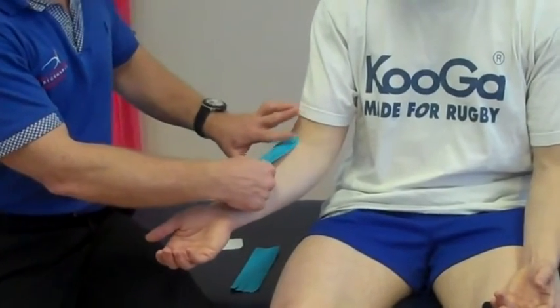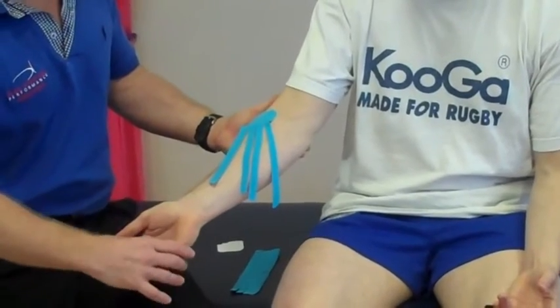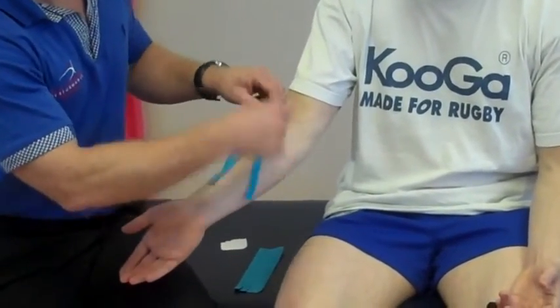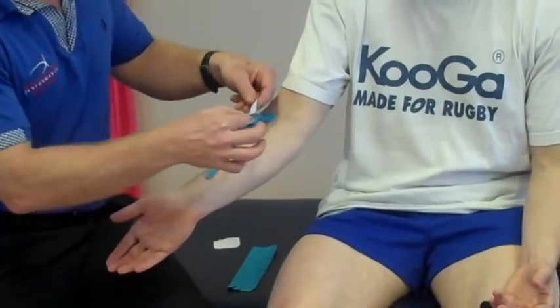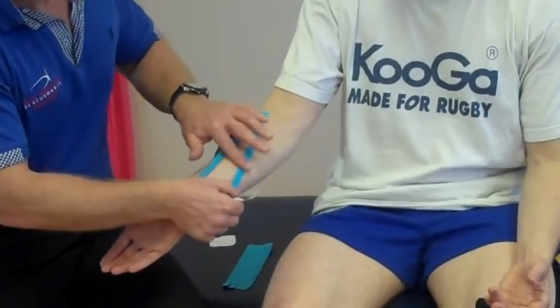Little to no stretch on the tape. I'm going to put his elbow into a slight extension and a little bit into extension on the wrist just to preload the tissue, and then using each of the legs we can literally peel back one and with little to no stretch just mold that around.